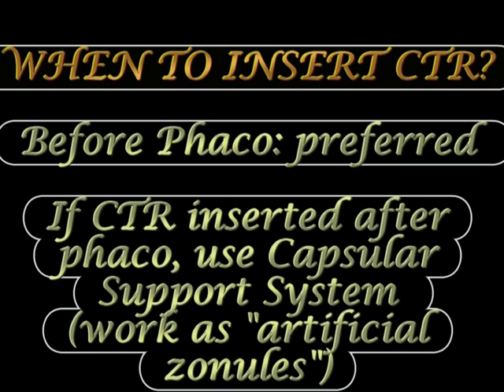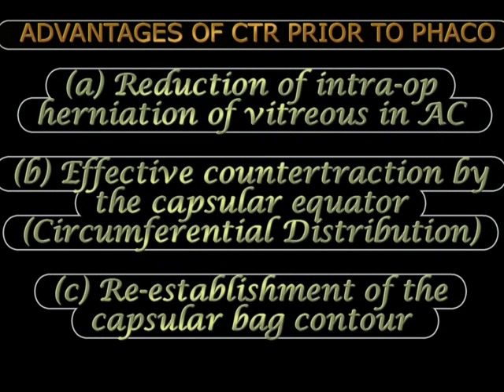Most surgeons prefer to implant the CTR before phacoemulsification as it provides stabilization during the procedure. However, if CTR is inserted after phacoemulsification, a capsular support system must first be used as artificial zonules for stabilization during phaco. The advantage of inserting CTR after phaco is better visualization and less risk of entanglement in cortical fibers. The advantage of inserting CTR before phaco is smoother surgery, less vitreous prolapse into the anterior chamber, and effective circumferential stress distribution preserving the capsular bag.